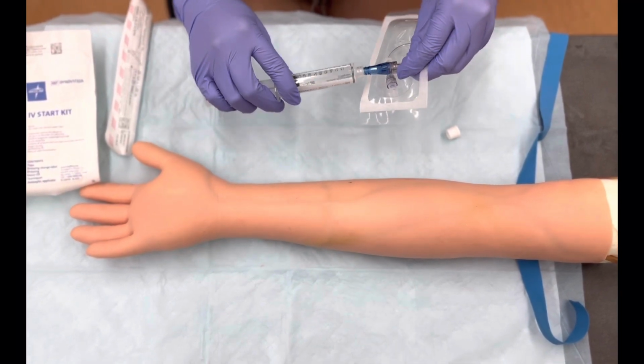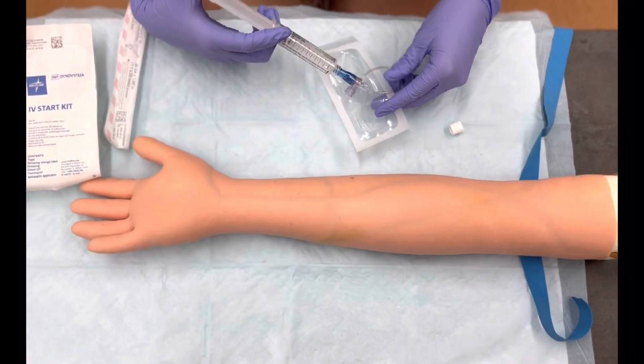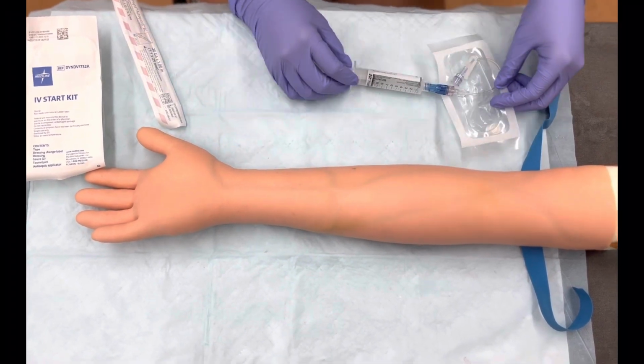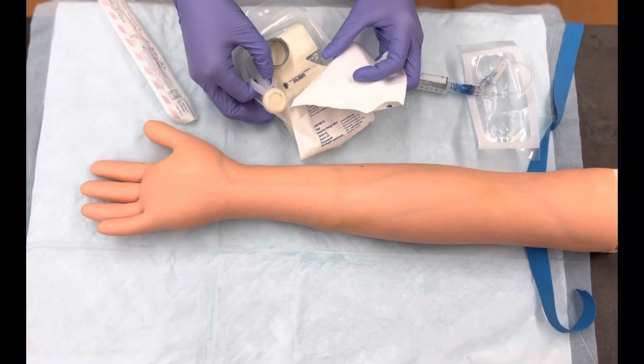Securely attach the luer lock end of the IV extension set to the sterile flush. Do not touch the point of entry of connection. Prime the extension tubing with the saline flush. Prepare your items for inserting the IV catheter.